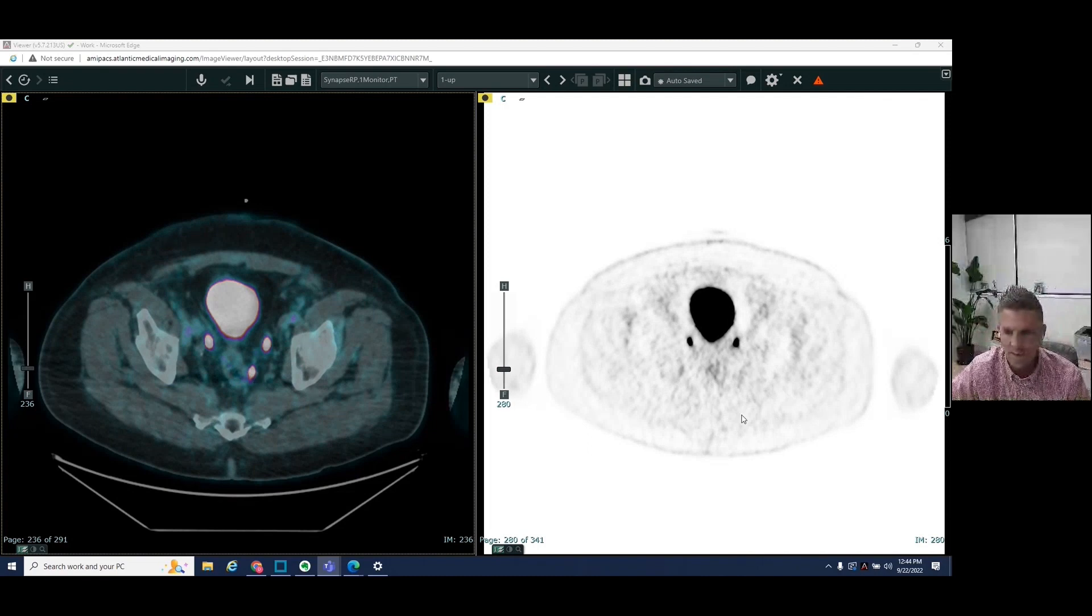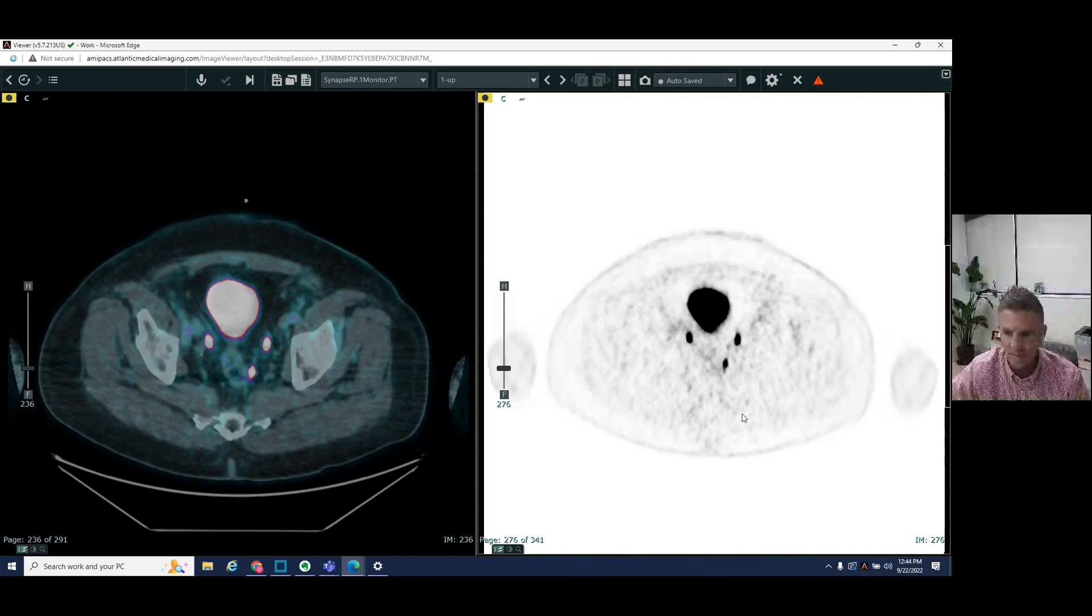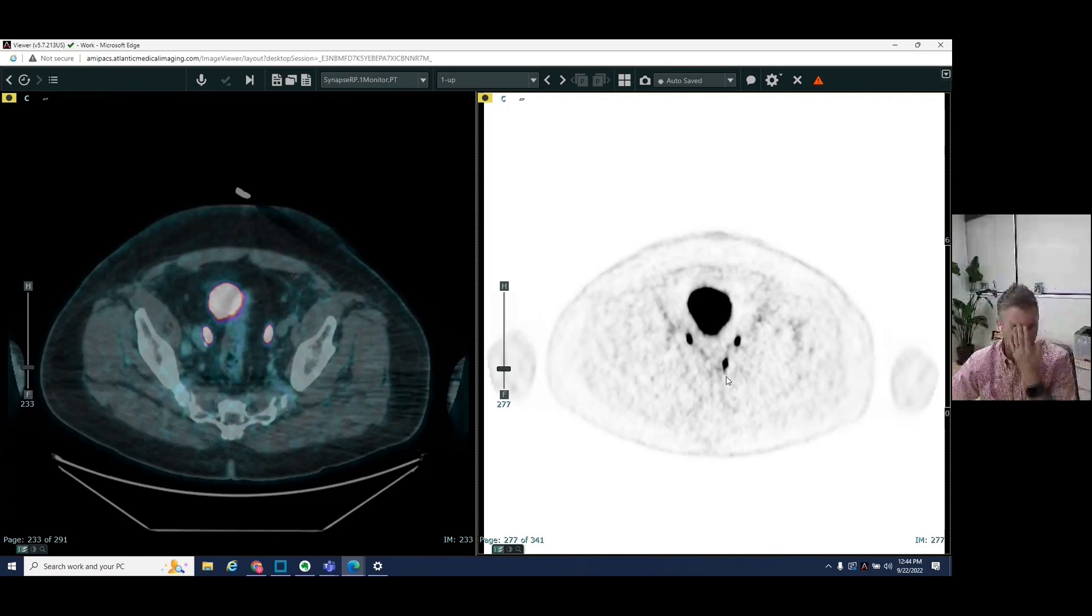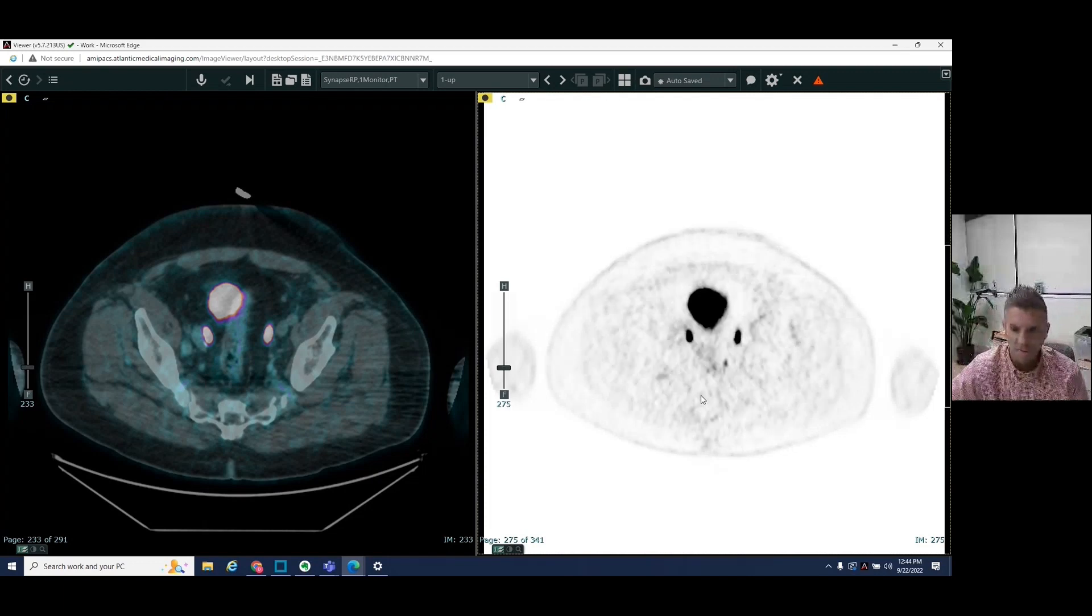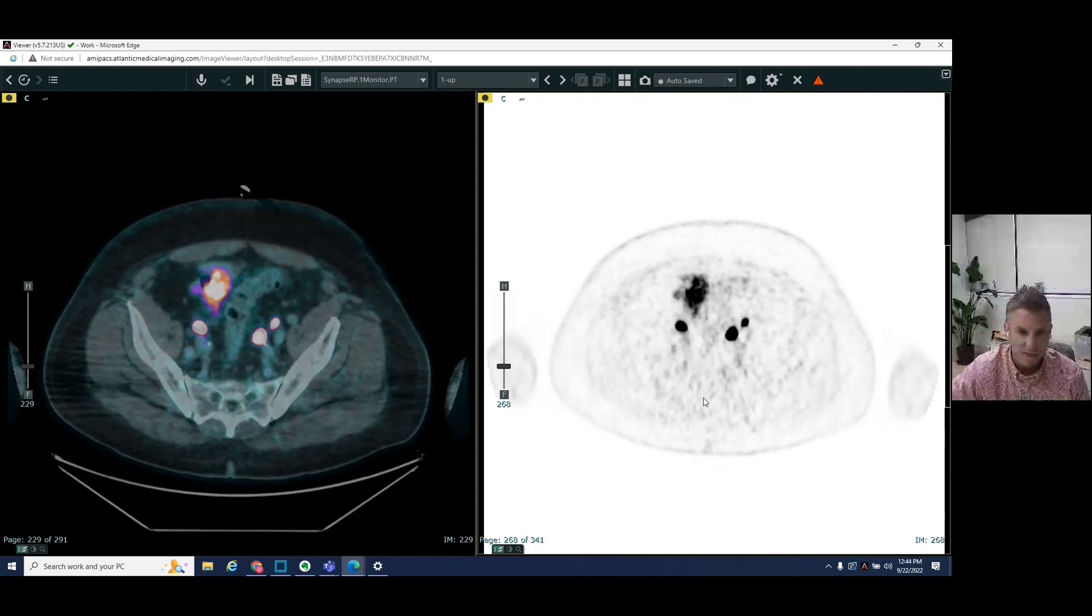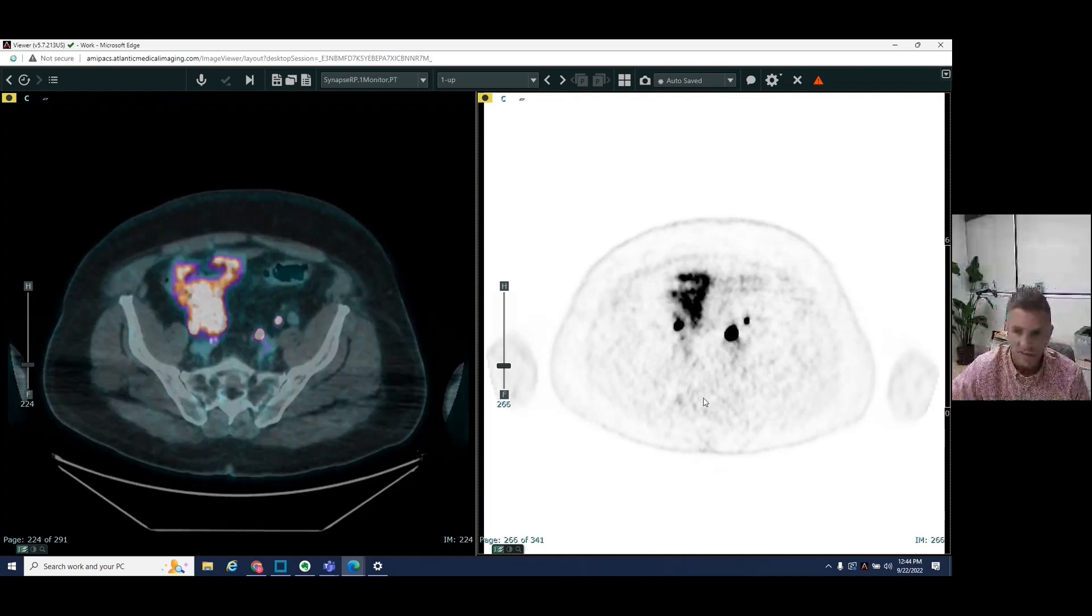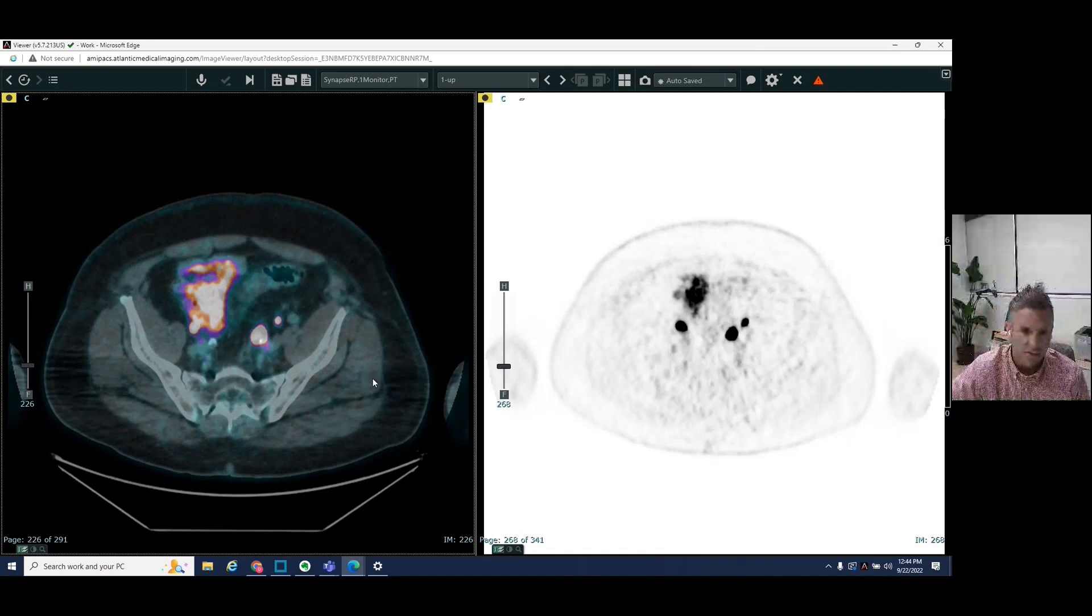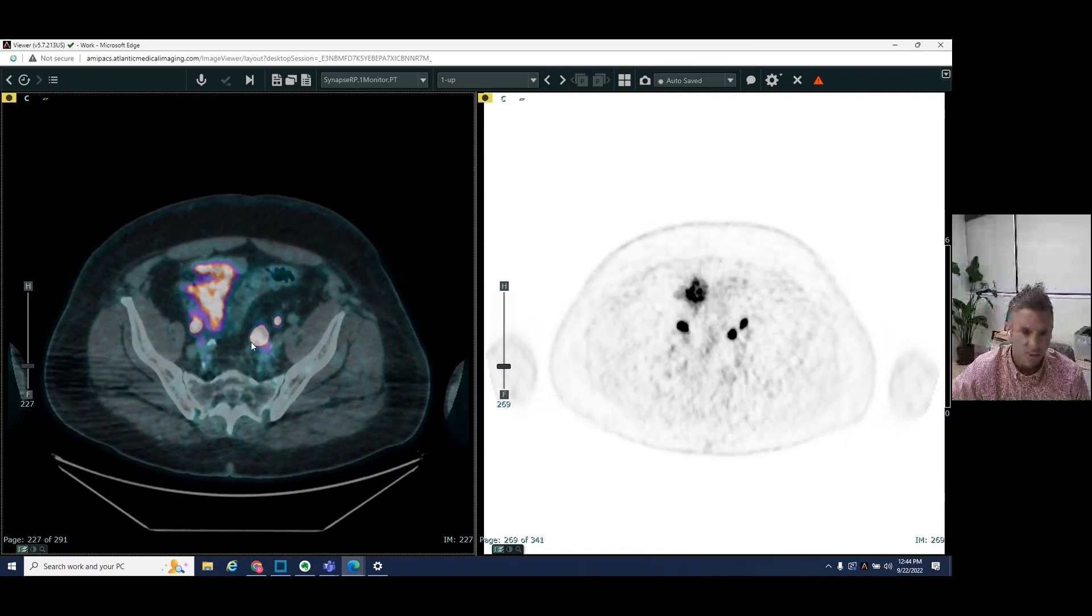It's a left perirectal lymph node. Again, we correlate that here. And so this is a metastatic left perirectal lymph node. As we go a little bit higher in the pelvis, we see another area which lights up, which is abnormal.